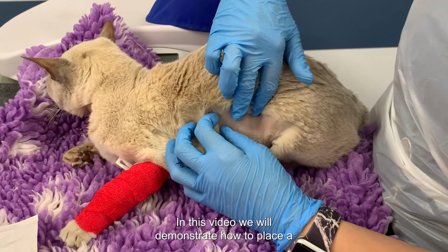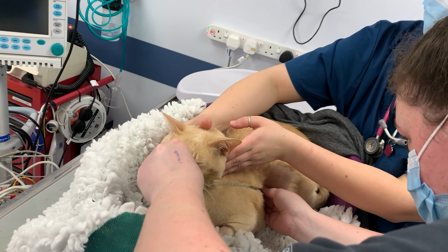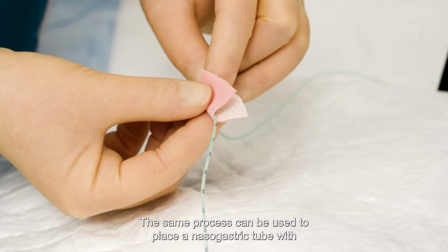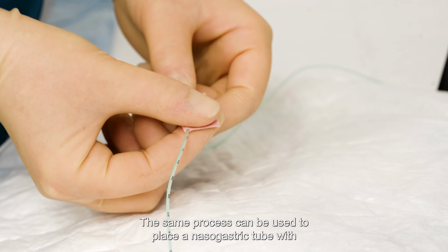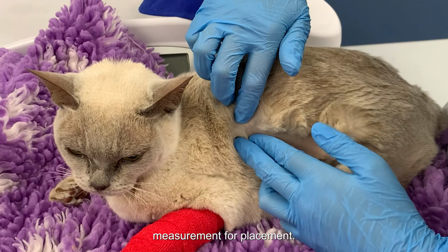In this video, we will demonstrate how to place a naso-oesophageal feeding tube in a cat. The same process can be used to place a nasogastric tube, with adjustments on how to check positioning and measurement for placement.